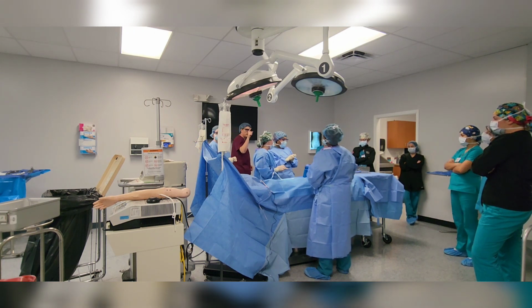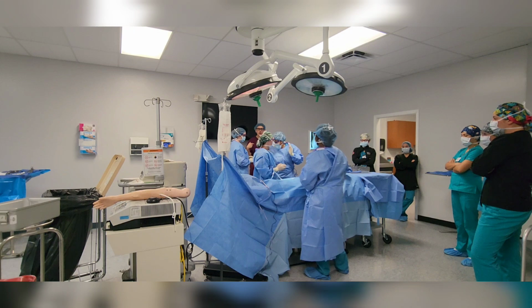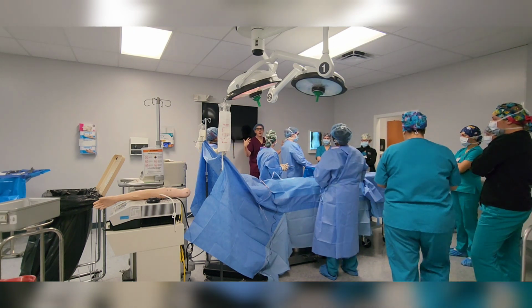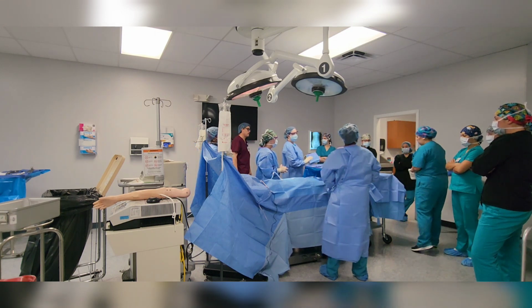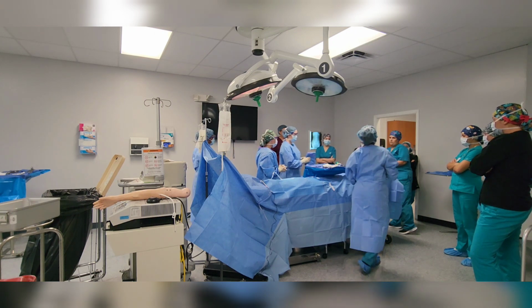So again, Karina, are you going to gown the doctor coming in? Just make sure you have that and anticipate that doctor coming in, right? And the first thing you should verify sometimes is, are they wet? You'll see dripping. Obviously, if they're dripping, what should you have? Towel. You should have a towel, right? In this case, she's probably not, okay? But how do you get that through the field?